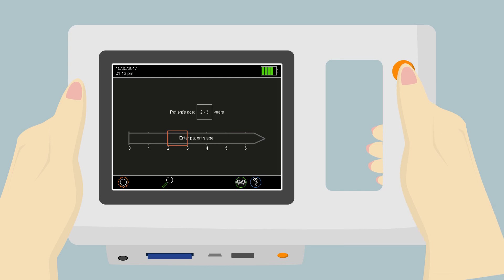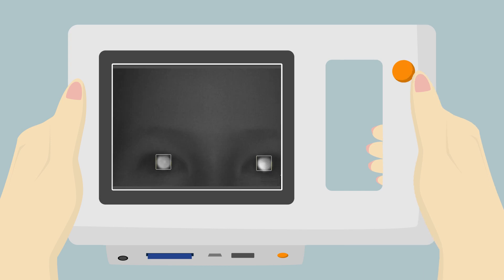Press and release the shutter button. An attention-grabbing warble sound will emit from the speaker in the PlusOptics device. Watch the screen and move it slightly until you see both pupils centered on the screen.